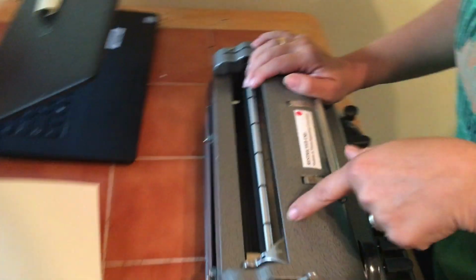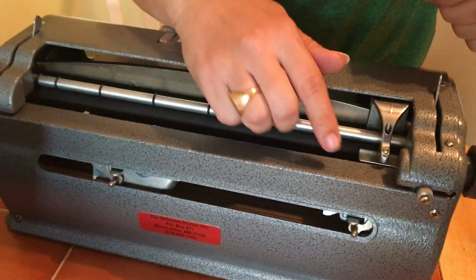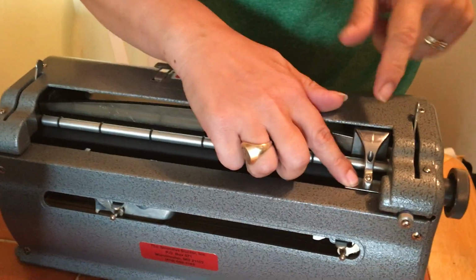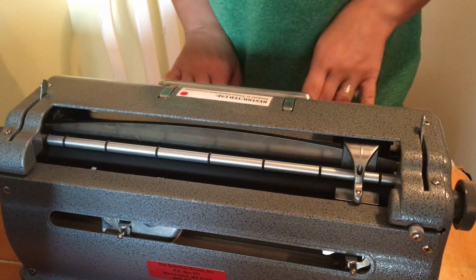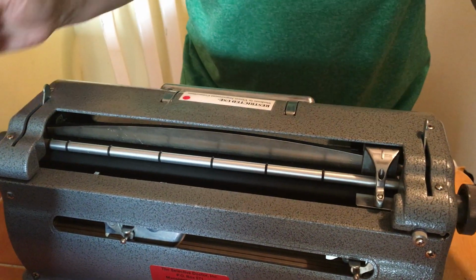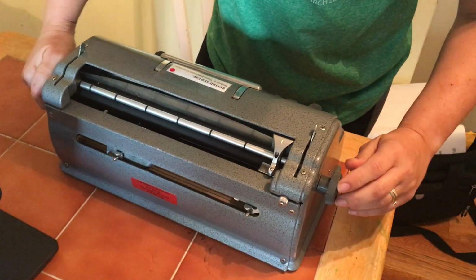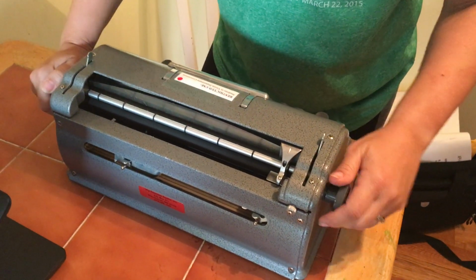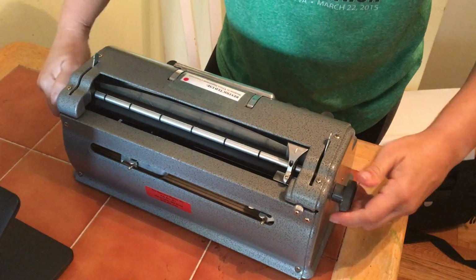This here is the embossing head. We have the embossing head and the embossing plate. The embossing head is what puts what you type on the paper and gives it texture. Here is the paper loader, or the paper roller. This rolls the paper around in the Brailler.